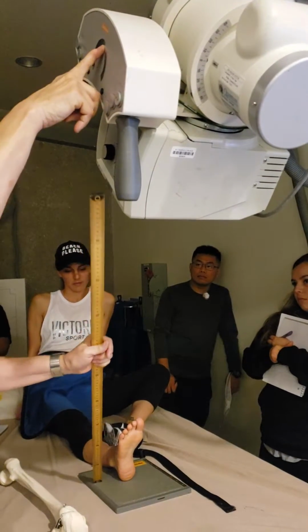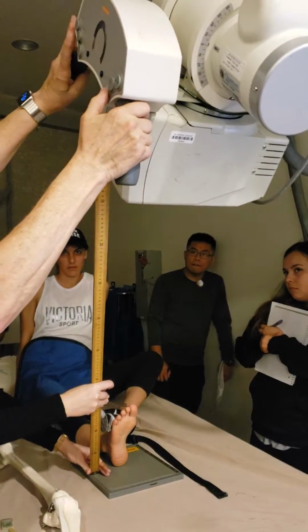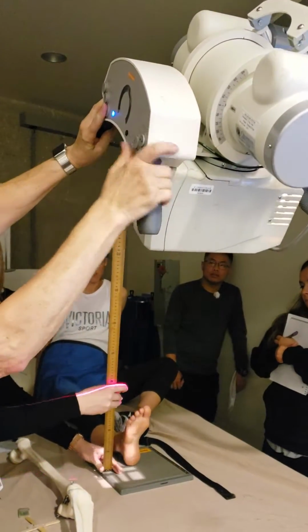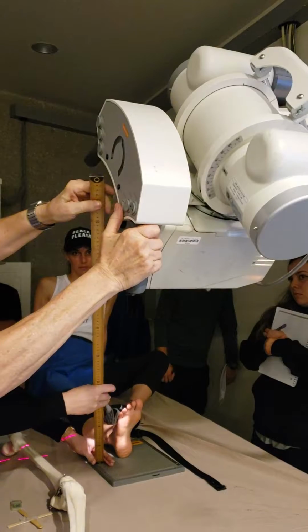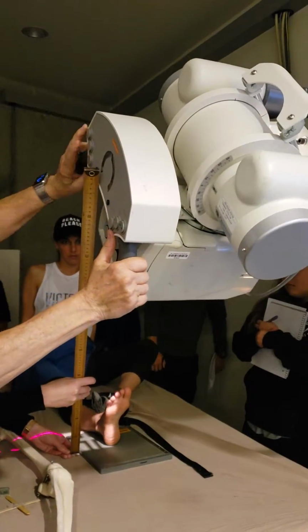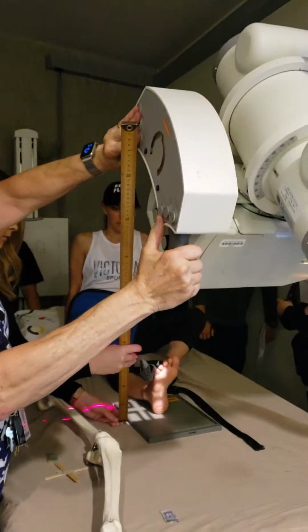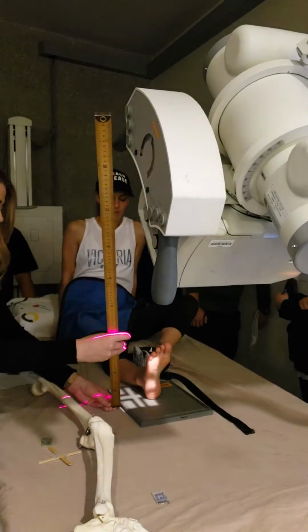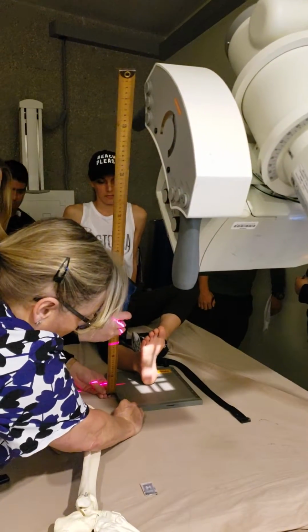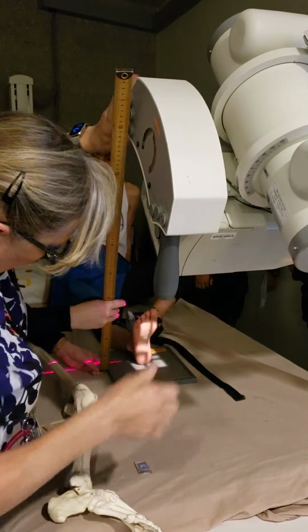Can you hold this for me? So if I bring the tube down this way, just vertically, watch what happens to my centering to the cassette. Bring it out so you don't... See how I've lost my centering? So what I normally would do is set it up to where I'm centered over the cassette and the part. I might be too close here, so I'm just going to center it to where it needs to be.